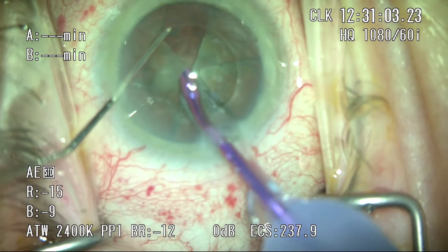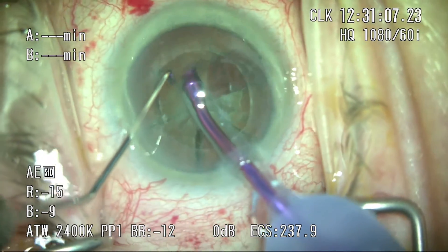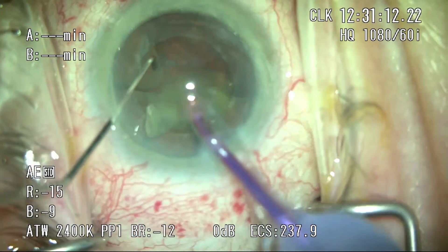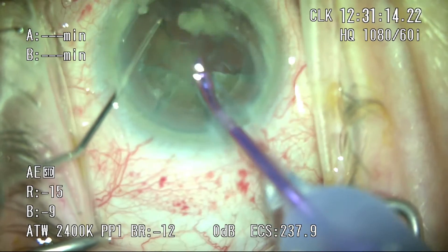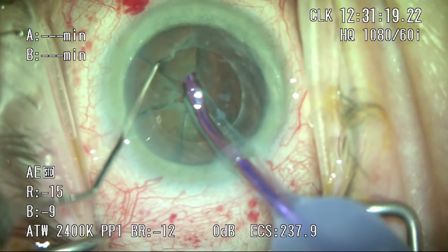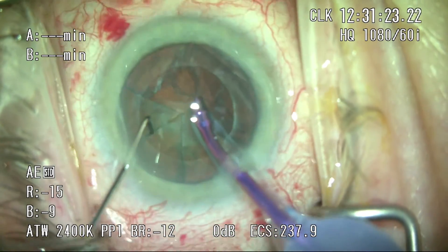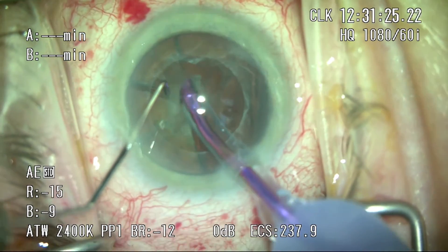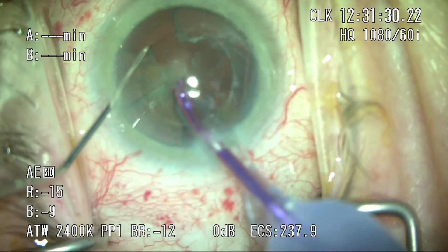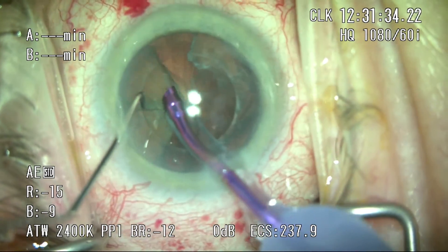My partner and I tried a number of different fragmentation patterns before settling on this one. The other patterns we looked at had arcs set circumferentially to create cylinders within the lens. We didn't like those because, as quick choppers, when we tried to impale the lens we'd lose a lot of the substance needed to get purchase. We found the six radial cut was ideal — four cuts left the pieces too big for evacuation and eight cuts left them too small.